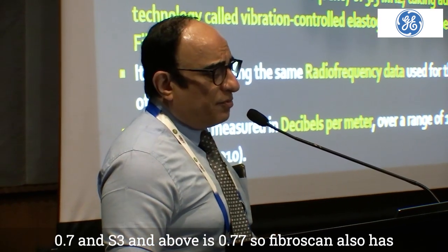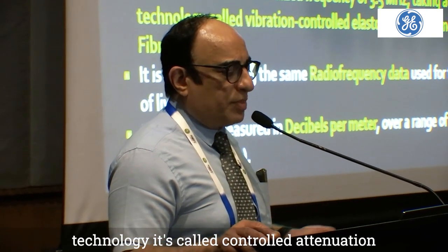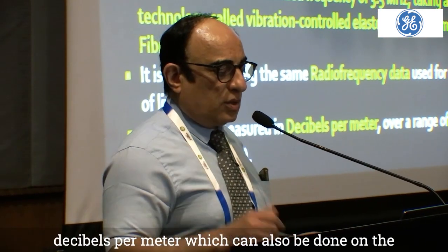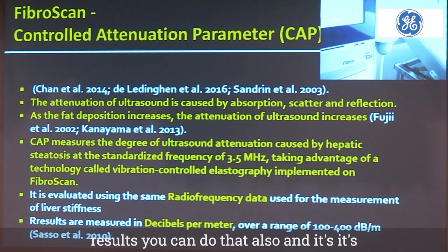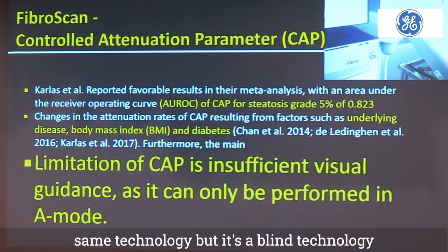Fibroscan also has technology called controlled attenuation parameter, which is the same and tells us in decibels per meter, and which can also be done on the UGAP machine. So it's dB per m here, in the range of 100 to 400. If you want to compare the results, you can do that also. It's the same technology, but it's a blind technology.